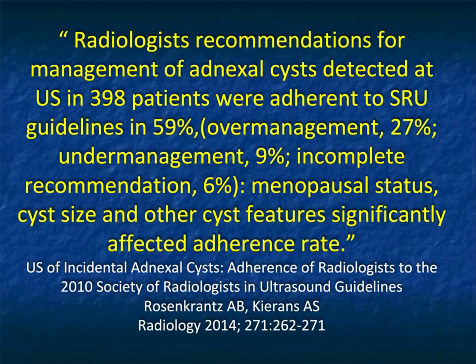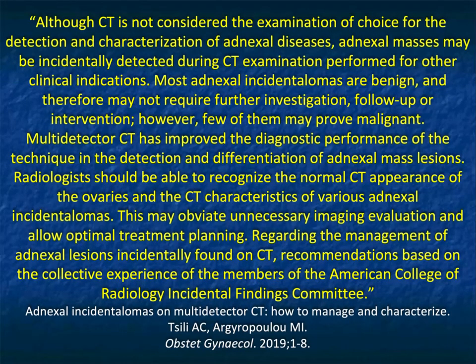Now, the next thing we should talk about is looking at cystic lesions of the adnexa. Again, this has been one of the challenges, getting people to follow the guidelines. Things that matter are age, cyst size, and clinical history. In this article by Say, Adnexal Incidentalomas on CT: How to Manage and Characterize, we realize that most adnexal incidentalomas are benign and therefore may not require further intervention or investigation. However, some prove malignant, and that indeed is the challenge.